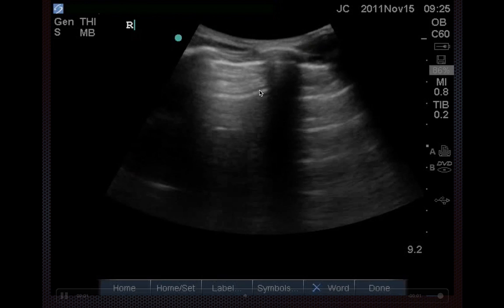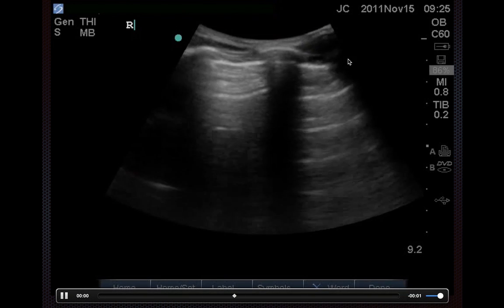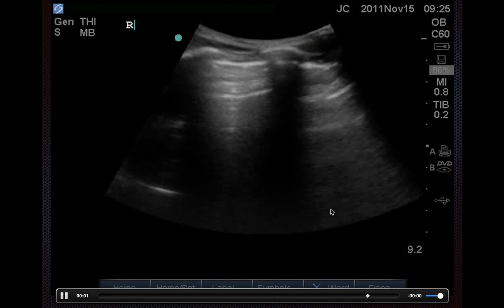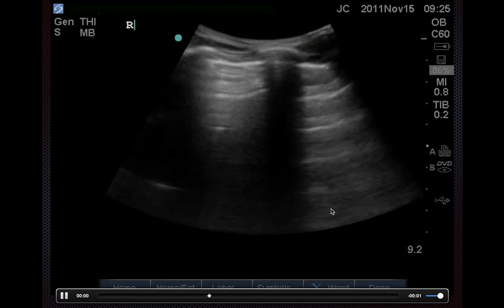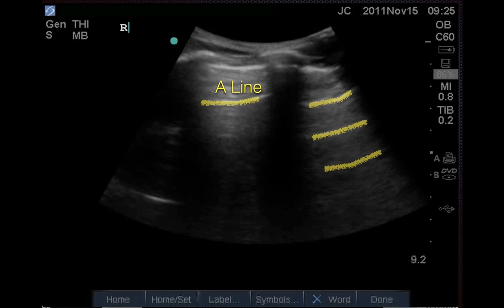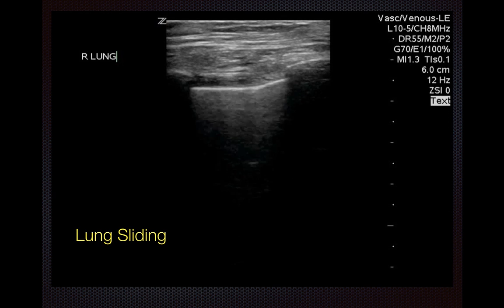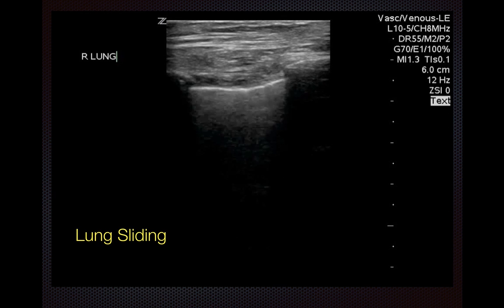This process is similar to what underlies B-lines, which will be covered in a later module. On a normal lung ultrasound you can see the bat sign and multiple recurrent A-lines. A key feature confirming that these are true A-lines is that they are equidistant — the distance from the skin to the pleural line equals the spacing between each subsequent A-line below.